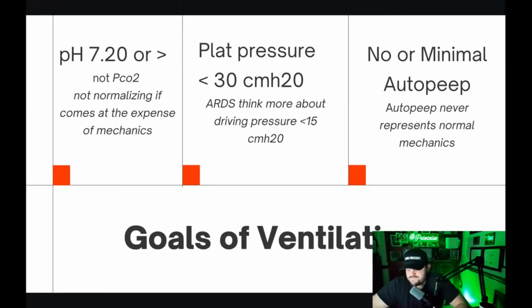This was a discussion today, where we had a driving pressure of like 17 or something, and the patient was on the ventilator, and they were like, okay. But the point of the post today, if you saw it on March 31st, was that the patient wasn't triggering any breaths.